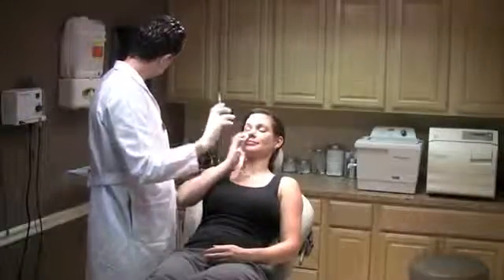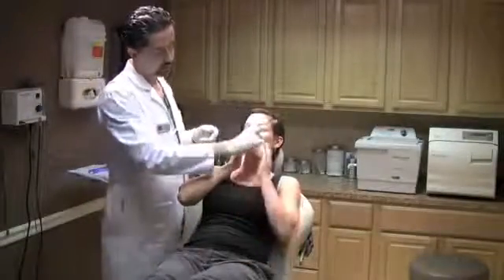This little bit of point bleeding will not bruise. It's very minor, and essentially holding pressure for about 2 minutes will stop it. I'll have you hold this, Jen. And she's lucky that there were no blood vessels in the way for the lips. So essentially the lips are done. She shouldn't have any major bruising. She can cover it with lipstick and she'll be ready to go out tonight.